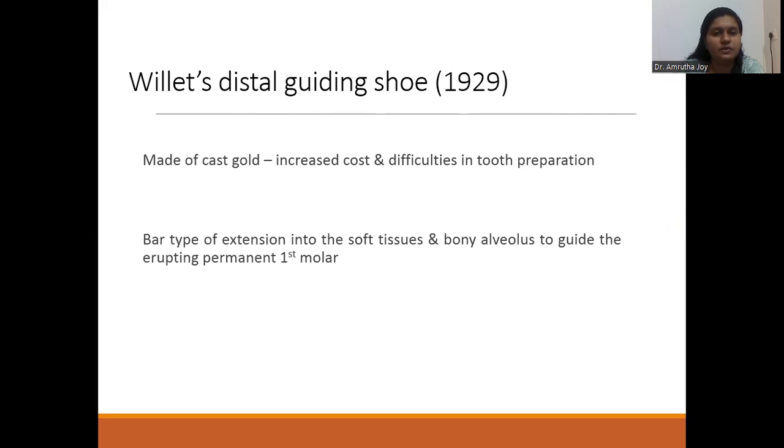There are different designs for the distal shoe appliance. One is the distal guiding shoe, and it is made up of cast gold, and it is of more cost and has difficulties in tooth preparation.